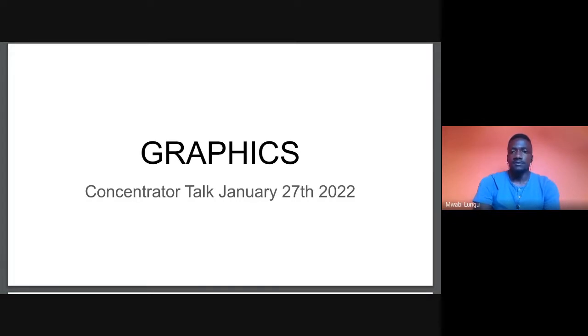The first question says, we have received a donation of zeolite 13X that could help us maintain the oxygen concentrators that we have. One of the concentrators has been giving out low oxygen purity, and we tried refilling the beds and they were not performing. We tried putting them in a fully functioning concentrator of the same model, which is the DeVilbiss 525. I will ask Mteto if you could please take up that question.